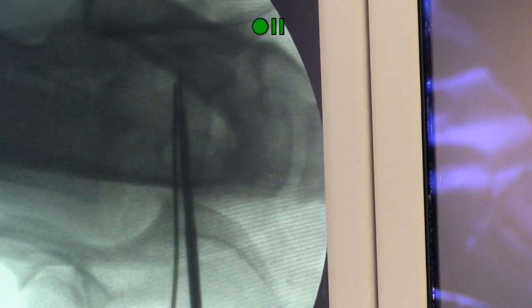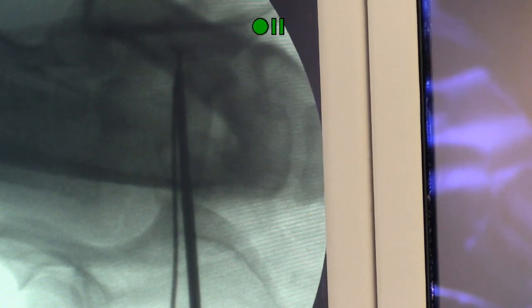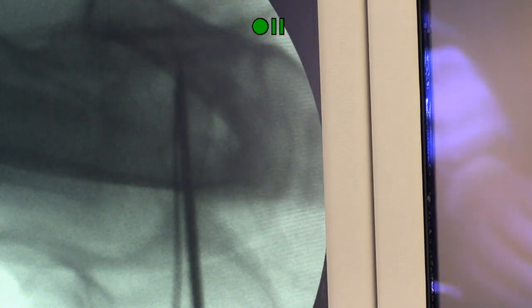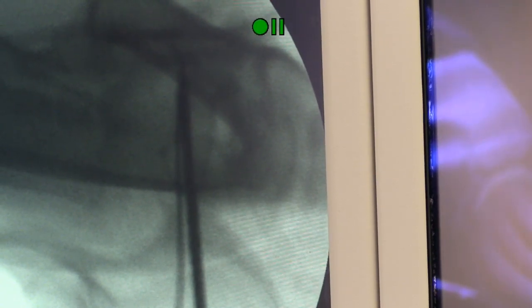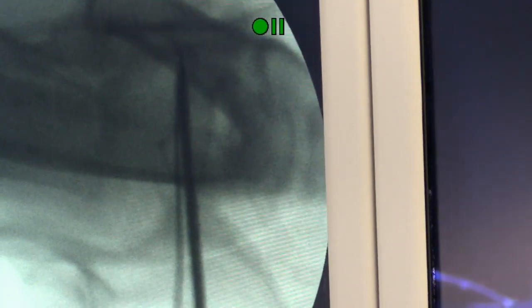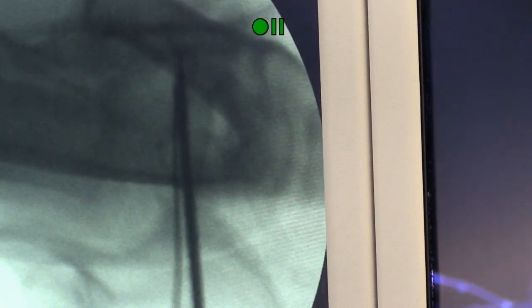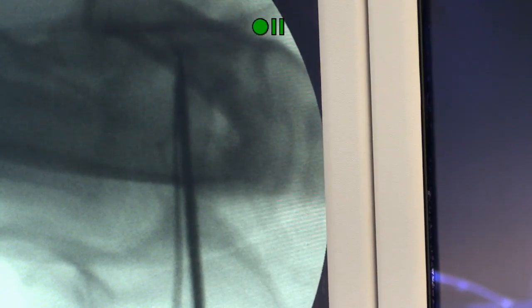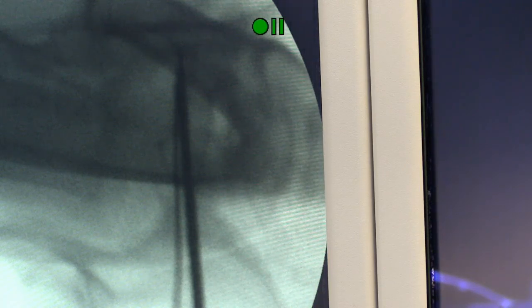So what size drill bit is that? It's a 2.5 drill bit. That's going to be for the far cortex, the trans-cortex of the sacrum, and it's 2.5 millimeters in diameter, so that the 3.5 millimeter threads will engage the bone.